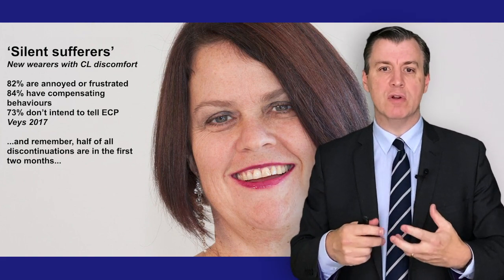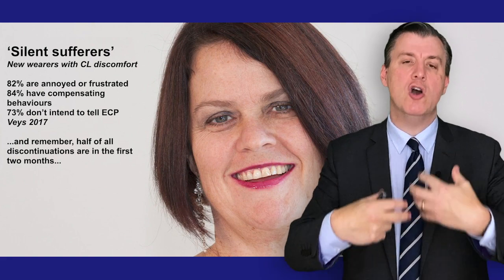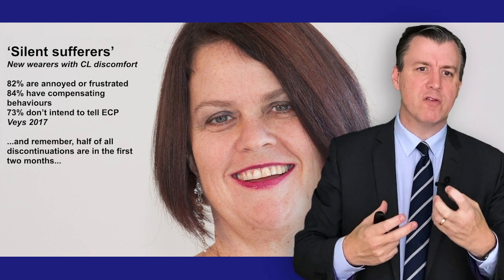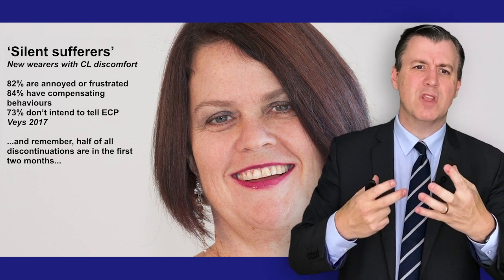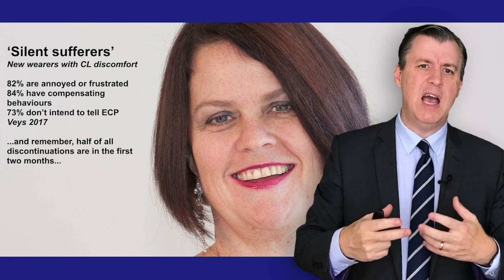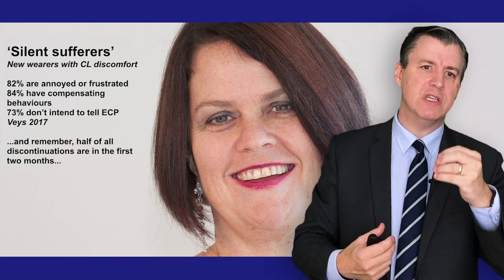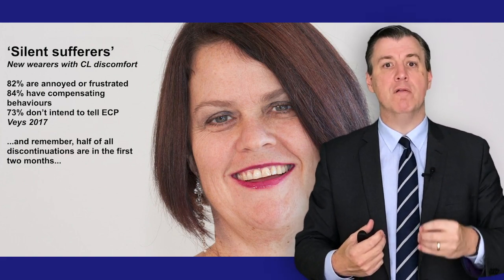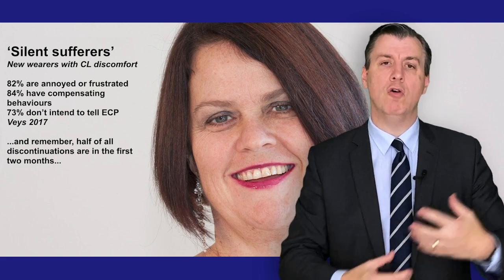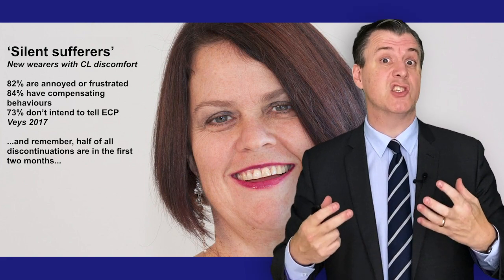It's astonishing to find out that when this has been looked at very carefully, a large number of people who go away and in the early weeks of their contact lens use have some contact lens discomfort find this extremely frustrating on average. They try compensating behaviours and maybe don't wear their lenses for as long or try other things. And we would hope that these people would return back to us and seek our advice. But a clear majority, 73% according to Vase, of people in this position do not come and ask their eye care practitioner. They'll look it up on the internet or they'll ask their mates, but they do not come and consult our advice. So this was something astonishing to me.